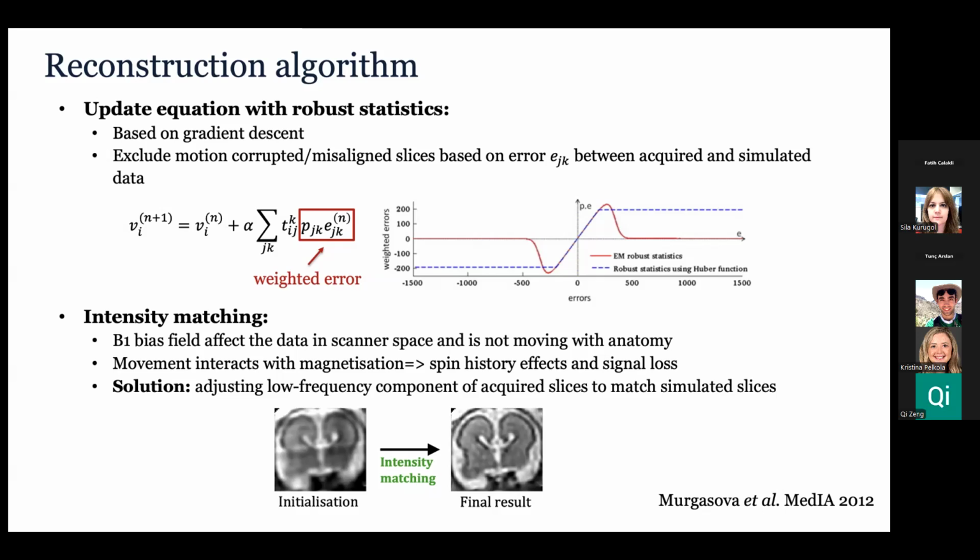So if you are lucky and the brain is in the flat area, you get extremely beautiful data. If the brain ends up being somewhere where you have loss of signal because of changing B1, then the data can be very noisy and not very nice. You can also get contrast changes because it's B1 transmit, not only receive. So the flip angle is not the same everywhere, and you can see less contrast on one side of the brain than the other. So there are lots of different issues with 3T.